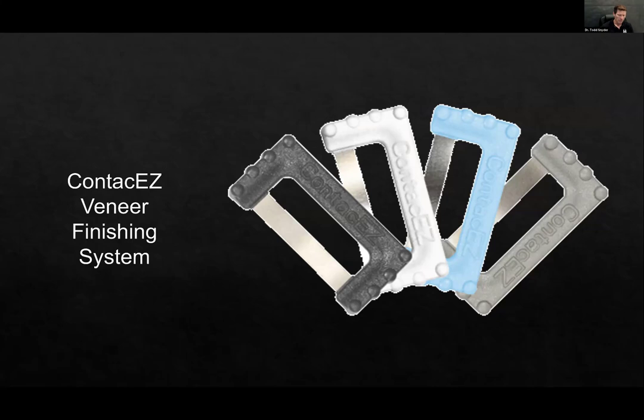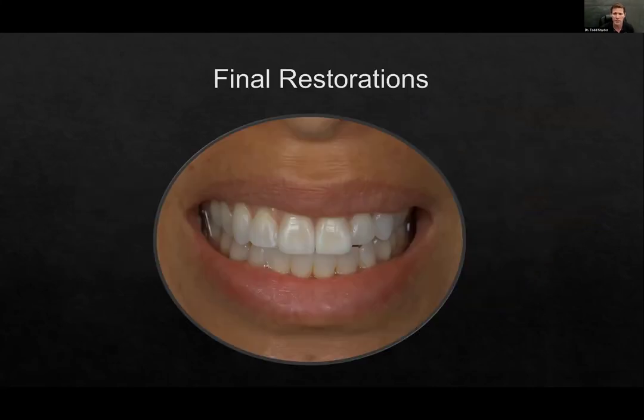Okay. All right. So once we've cleaned everything out, we now have the patient looking great, feeling great. Obviously, we're going to have them back a week later, double check everything. But that's as easy as it is to put things in. And so it's really not that challenging. Once you start to look at it and break down the steps and go, okay, if I follow these steps, it becomes very easy. I would say the hardest thing is just making sure you follow the steps properly and put proper treatment on the tooth structure as far as your etchant or selective etch and your adhesive. You get those right, it really becomes quite easy.